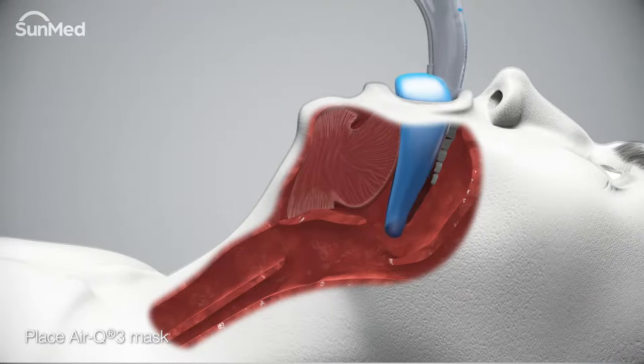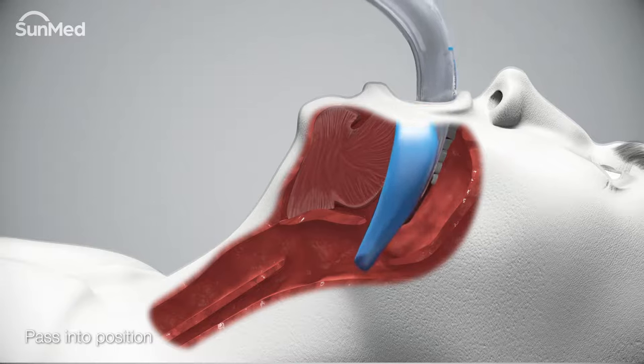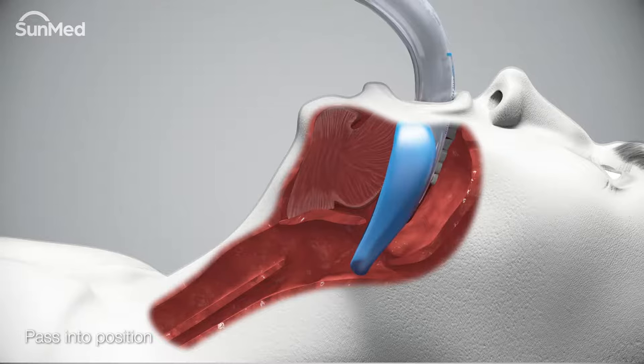If possible, pass the air Q3 mask into position within the pharynx by gently applying inward and downward pressure, using the curvature of the air Q3 mask and airway tube as a guide.